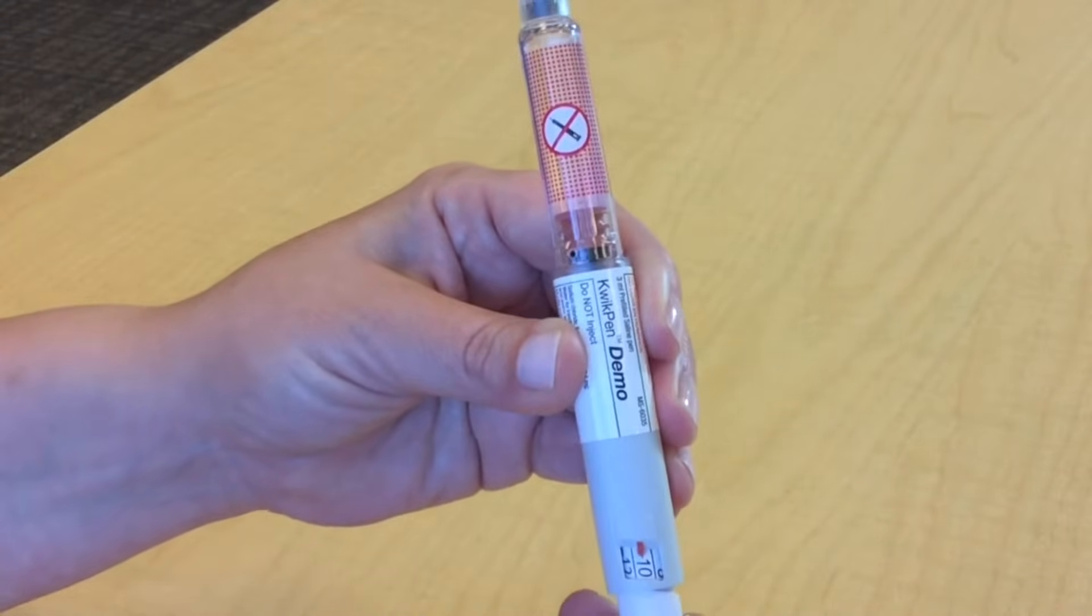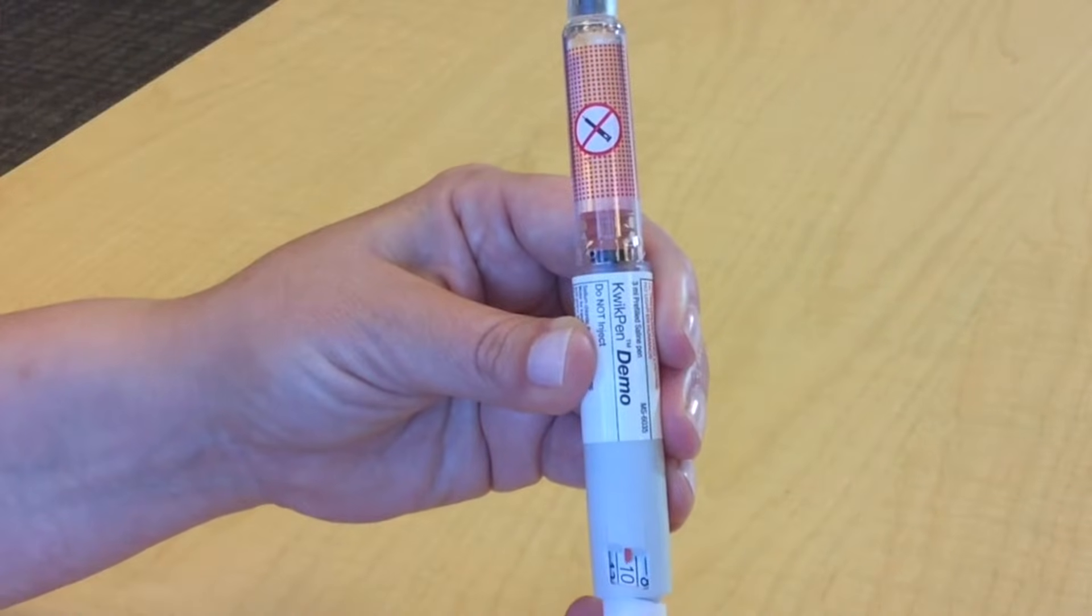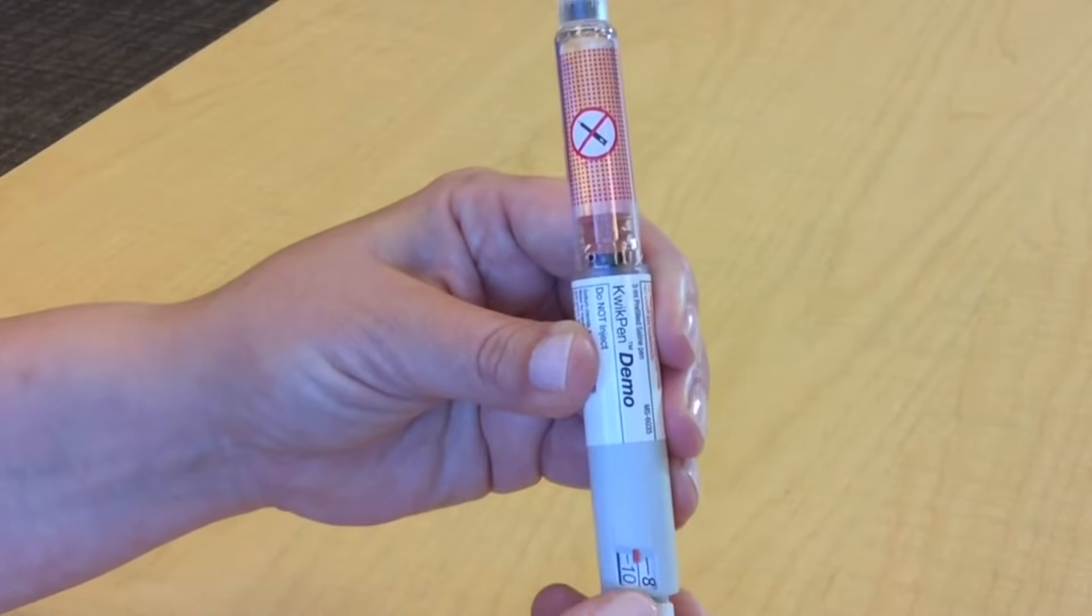If your dose is 10, line it up with 10. If your dose is in between the numbers, like 9, line it up in between.